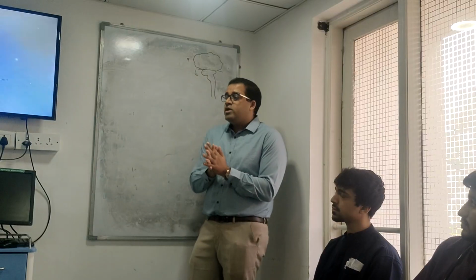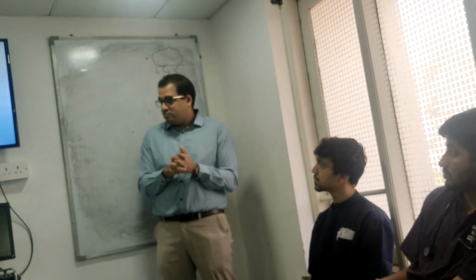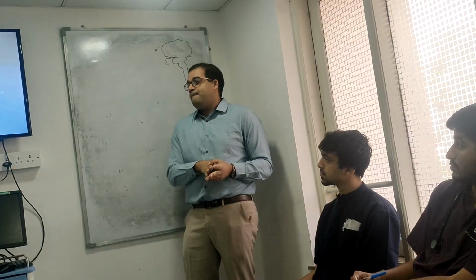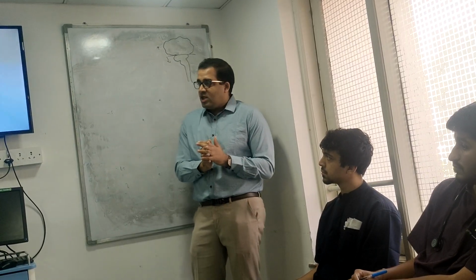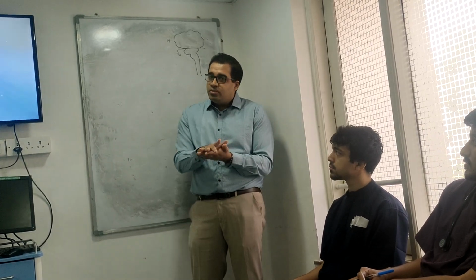Staph. Okay, you're worried about staph. So what will you ask the lab technician even at 12 midnight, जैसे GPC आया है? What will lead me to think ये staph है या staph नहीं है? Staph bacteremia is very important. It's an emergency. You will ask for morphology on the slide. You ask whether it is in chains or clusters. Okay. Important. ये basic है.